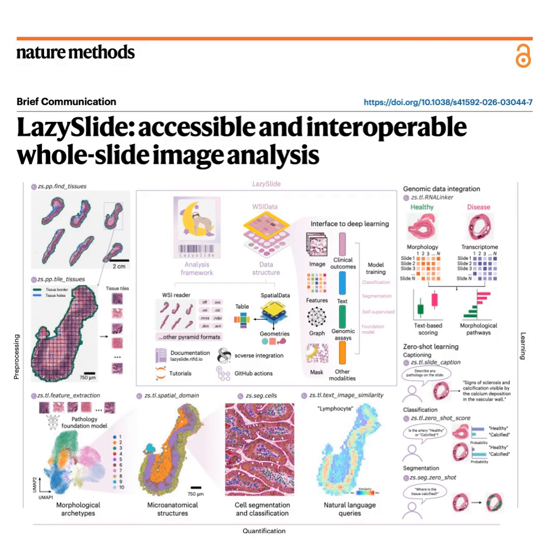It's astounding. And you can take that text alignment even further with SAM too. That's the segment anything model. Yeah. Because LazySlide knows the exact coordinates of the tile that scored the highest cosine similarity to your text prompt, you can pass those coordinates into SAM2. So wait, if I type glomerulus, the vision language model finds the spatial location of the glomerulus, and SAM2 automatically draws a precise boundary line around it. Completely label-free. That is incredible. If you're a pathologist listening right now, the idea of typing a biological term and watching the software instantly snap a boundary around that exact structure on a gigapixel slide, I mean, that is just staggering.